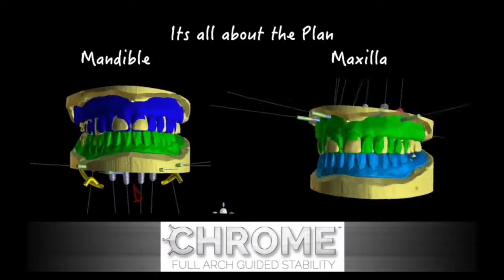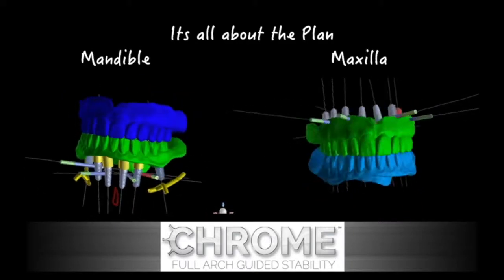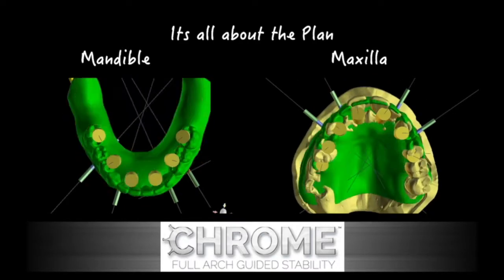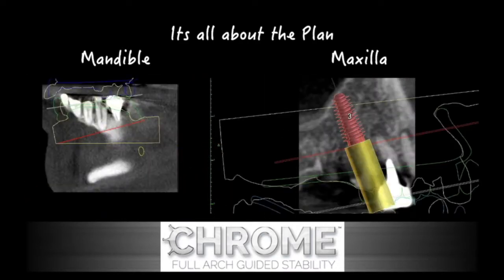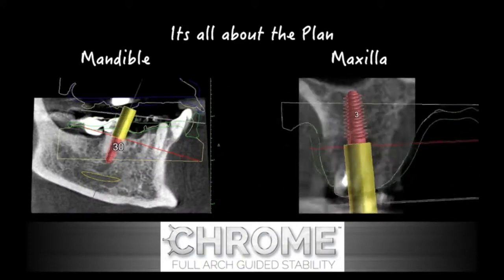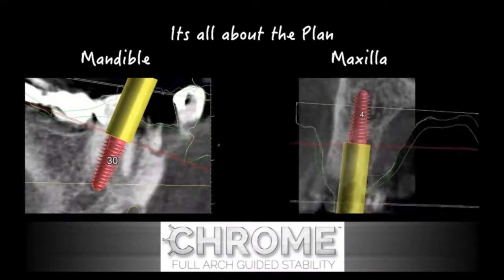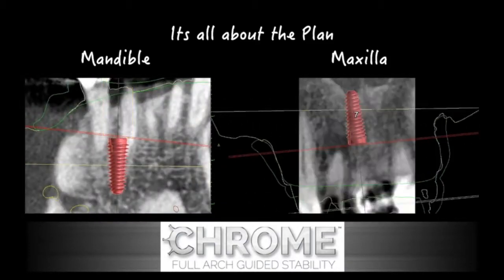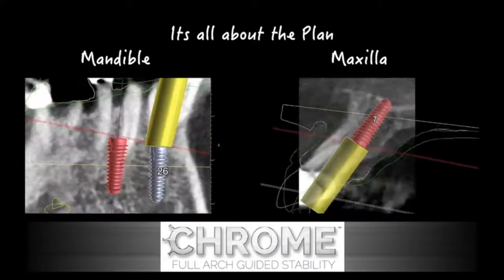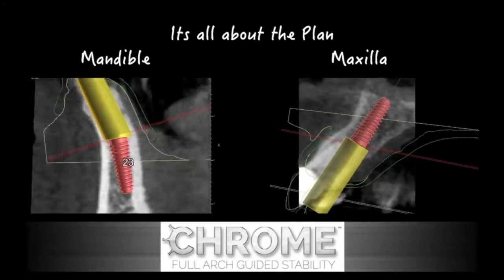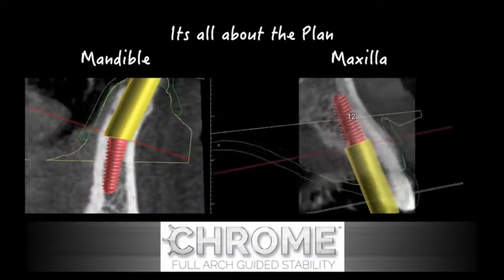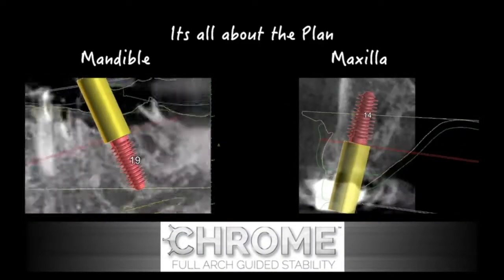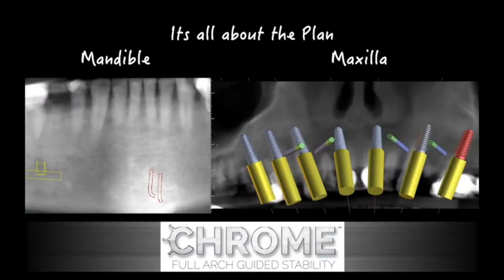Once we have the cone beam CT, we want to be able to merge the information with the existing stone casts or impressions. We then can take that data set and plan the position for each implant. We want to be able to rotate around the implant 360 degrees to make sure that we do not impinge upon any vital structures. As we visualize each implant placement, we may also discover that we will need angled abutments in order to achieve the result that we want.